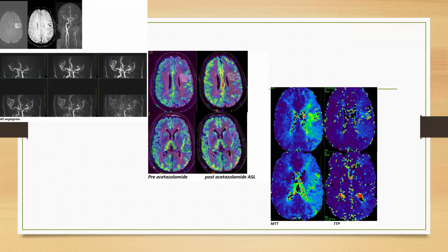Usually IV assessment is not there in India. We do it with tablet acetazolamide challenge, and we give tablets, and after an hour we take the images, pre and post acetazolamide ASL images. And in some of the cases we also did a contrast perfusion and 4D angiogram.